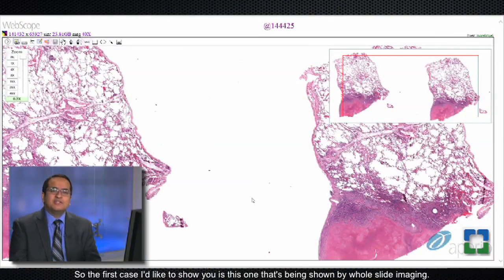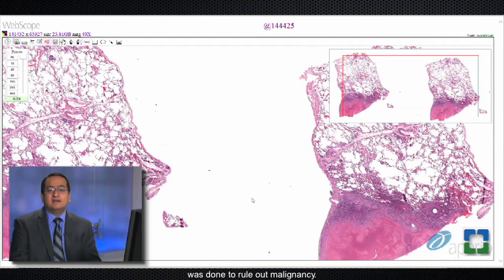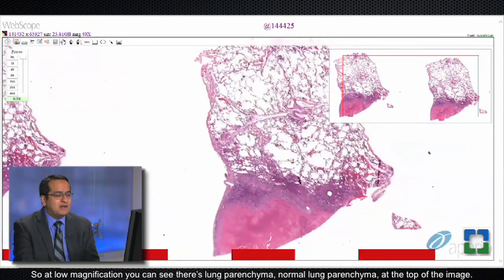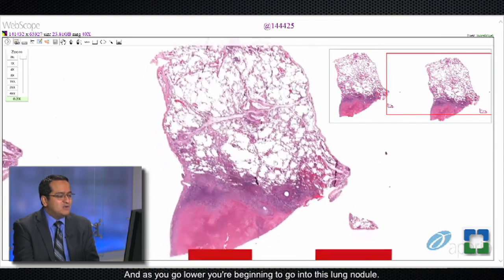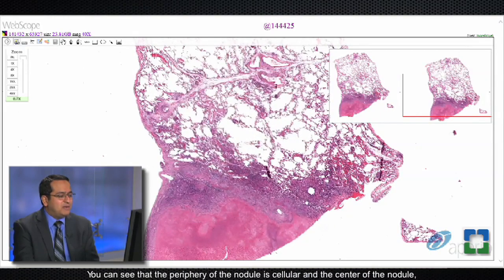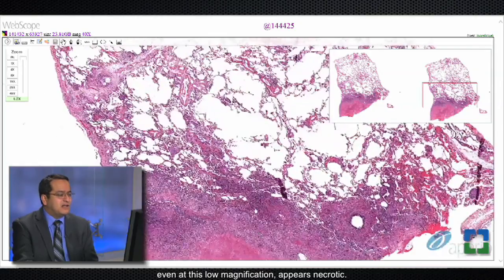The first case is being shown by whole slide imaging. The lesion was actually a lung nodule, and the surgical lung biopsy that you see here was done to rule out malignancy. At low magnification you can see normal lung parenchyma at the top of the image and an interlobular septum, and as you go lower you begin to enter this lung nodule. You can see that the periphery of the nodule is cellular and the center appears necrotic even at this low magnification.